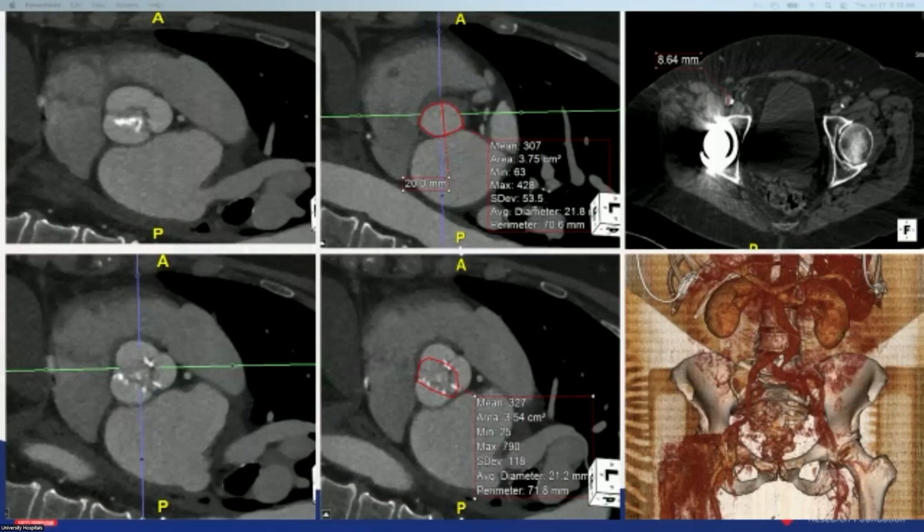I mean, I think this is one of the... I didn't catch the patient's BSA. 80 years old, and a big patient? BSA is... 1.73. Okay, not big. So, especially in a horizontal aorta, I think the tip-deflecting catheter, I think Sapien has some nice features. And so this type of bicuspid, I'd feel very comfortable.